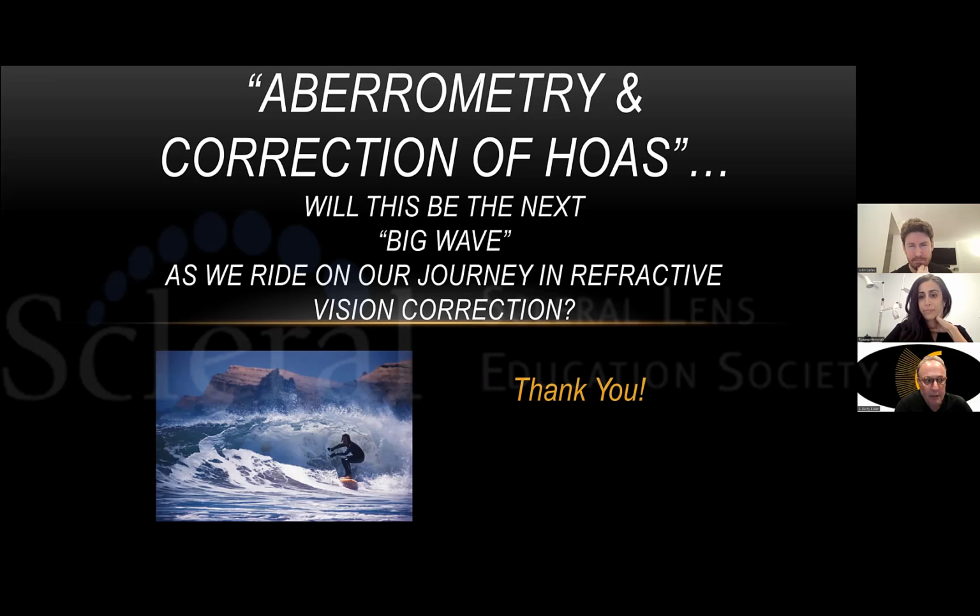My take is, without having an aberrometer, if you put a scleral lens on, and we don't get the kind of improvement in acuity and quality of vision, even as the patient says to you, those patients who start reading the eye chart like A, P, P, S, so what I'm saying is that they're not seeing it well, even though they may have a quantified acuity. You have to be suspicious after a well-performed over-refraction that there are residual HOAs there.